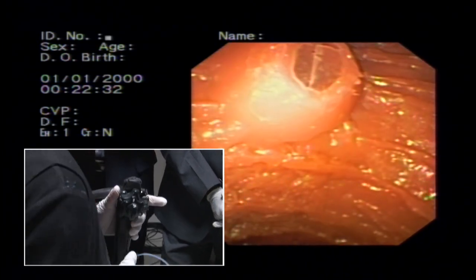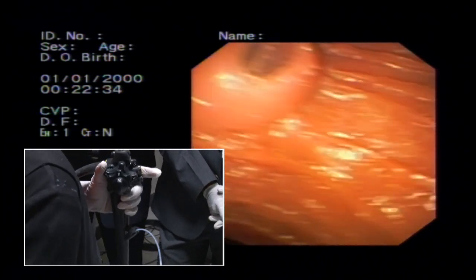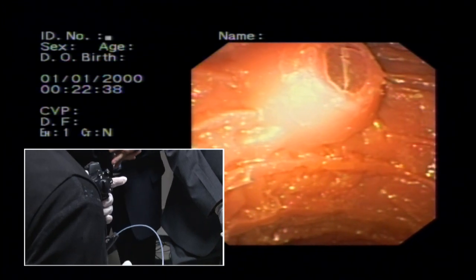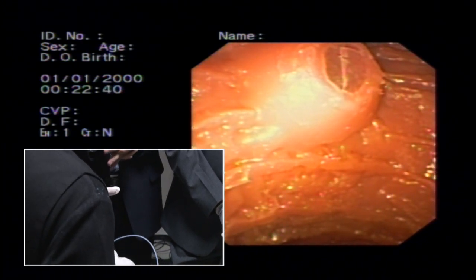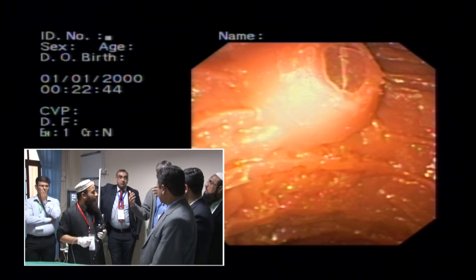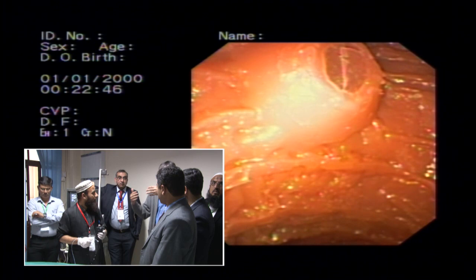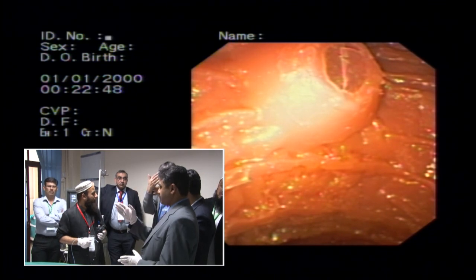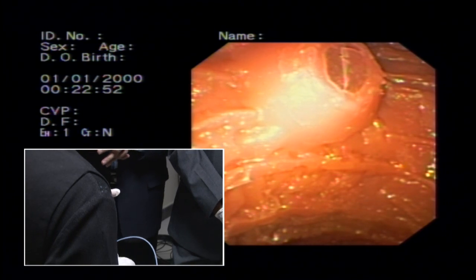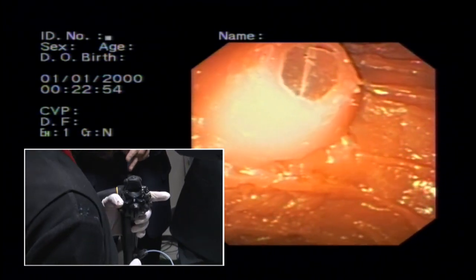Sometimes even this movement that you have, depending on what your position is when you've got the cannula in, you can also use that to actually help push the cannula. Because if the ampulla is like this and you're going this way, it facilitates just advancing your cannula once you're in. So, or the same movements.